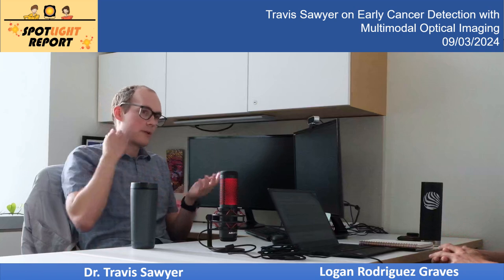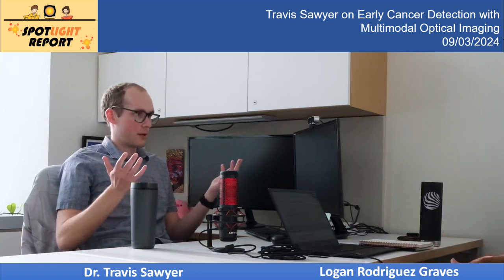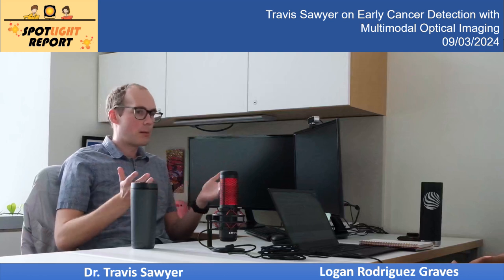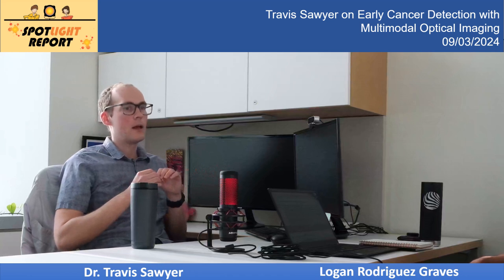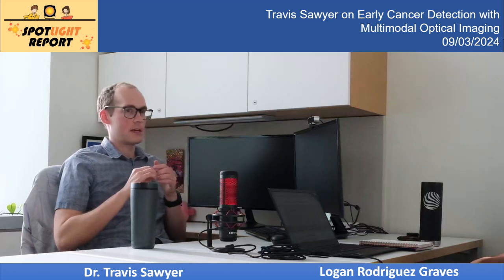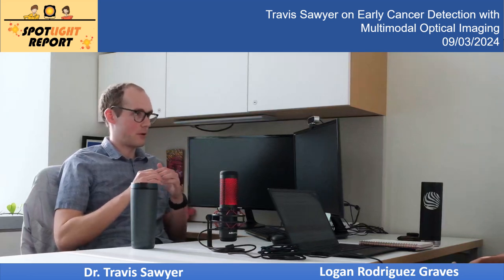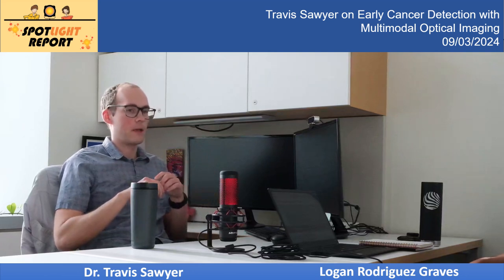Sure, yeah. So the lateral resolution is similar to any lateral resolution concept in optics. It's probably going to be dictated by diffraction, but depending on how your system is, it might be aberration limited. OCT systems tend to be really low numerical aperture, and so they don't suffer from terrible third-order aberrations. A lot of it ends up just being Gaussian beam math and that type of thing.